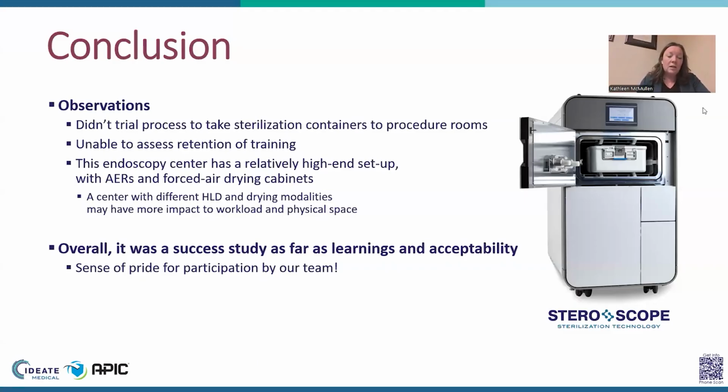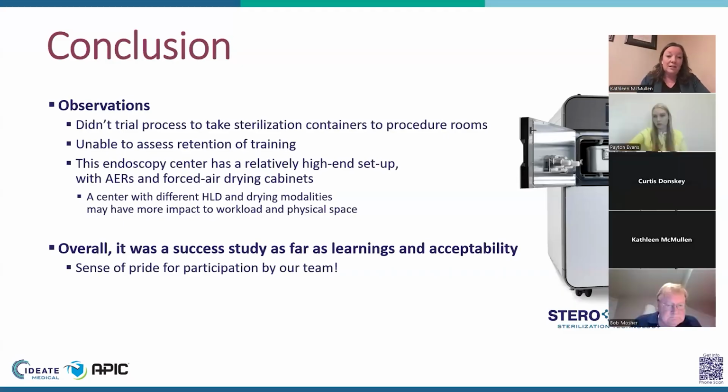And then overall, there wasn't a ton of differences for us from moving from high-level disinfection to sterilization. That is partly because of the setup that we have with the automated endoscope drying cabinets and the AERs. So a center that was moving from a different sort of current state may need a very different footprint or a lot of changes. Overall, as I said, the study was a success. We were really excited about the opportunity to move this into some of our newer areas in the future.